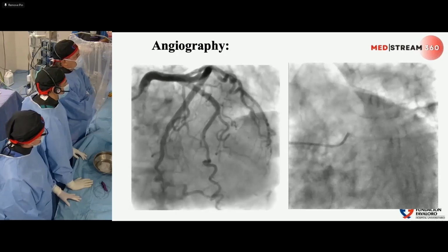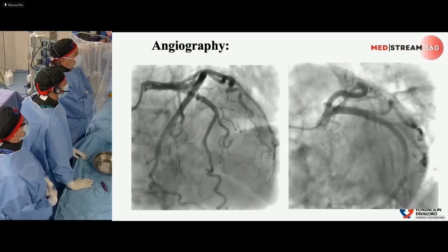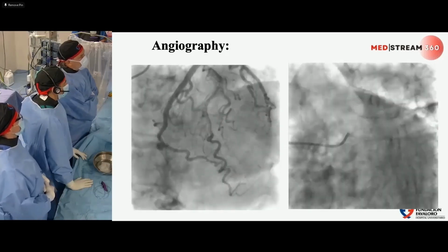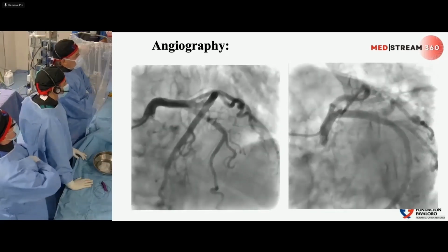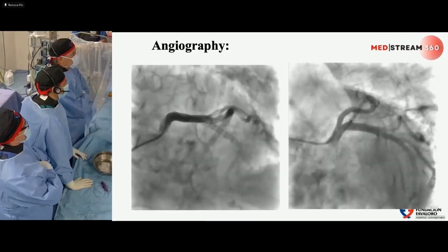This is the left cranial and then the left caudal view, where we cannot observe any significant lesion except this bridge, a not occlusive bridge, in the middle segment of the LAD. Next.